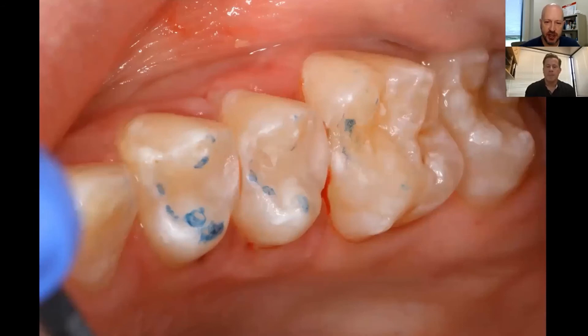With the matrix system off, you're checking occlusion, and you can definitely see that you've been able to contour those marginal ridges really nicely and keep the occlusion off them as well. Anytime I can keep occlusion off of a restoration, I try for that. God-given tooth structure is more durable than probably anything we have in dentistry. With the contours and the nice rolled marginal ridges, I think we've got a win on this restoration that will foreseeably be a long-lasting restoration for this patient.